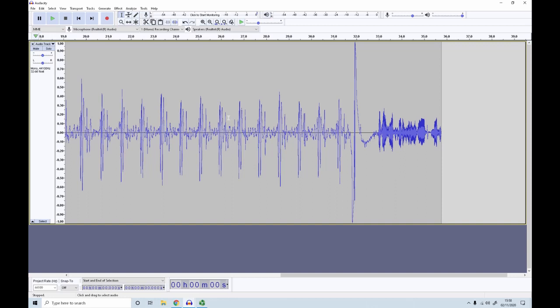So there's a lot of information that can be gained from this kind of waveform, and as you move the microphone around you can hear different elements of the heart sounds, namely the different valves that are shutting and indeed potentially the blood flow through the aorta if it's a little bit turbulent, as well as potentially sounds emanating from the heart hitting the chest wall.